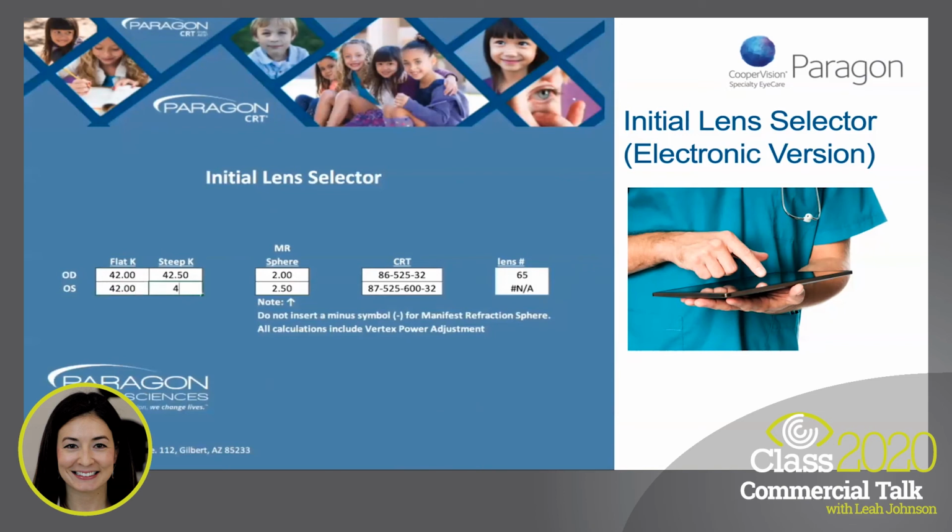Depending on the corneal toricity between the flat and steep K, you may have a CRT lens, or if there's greater than 3/4 of diopter of corneal toricity, the calculator will recommend a dual axis lens. Here in the circle are the parameters that we will want to start off with.